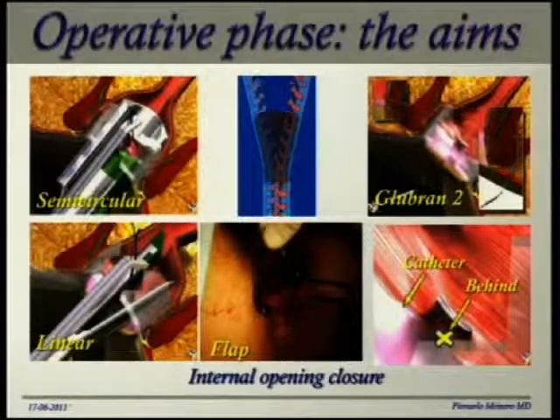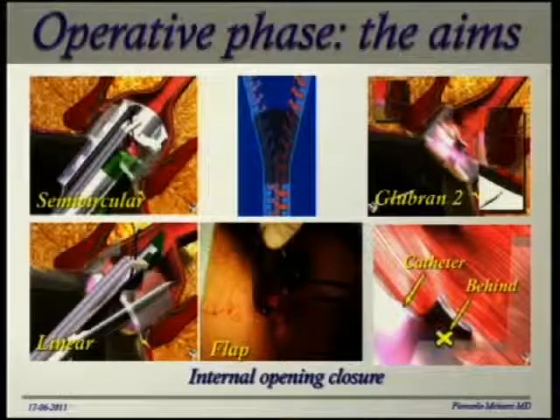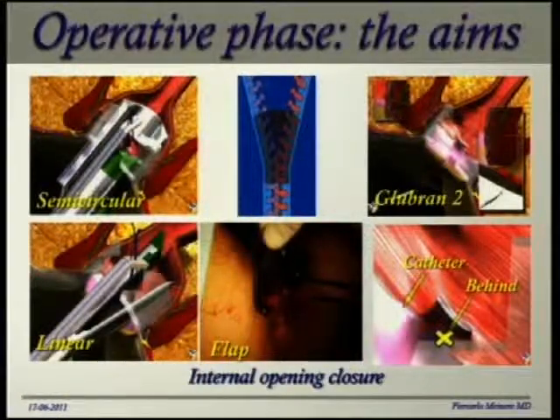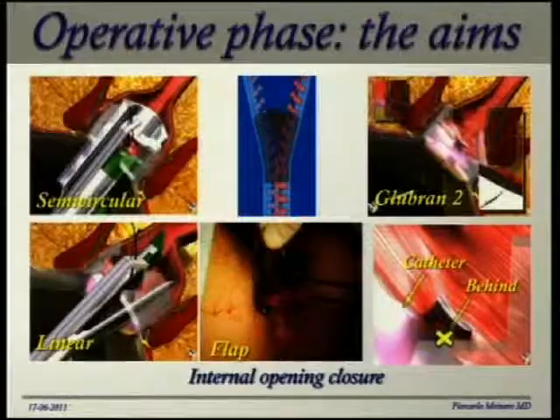The final result is simply a scar in the area where the internal opening was. But when the internal opening tissue is not sclerotic and allows you to make a good volcano, the stapler works better. But if the internal opening tissue is too rigid and sclerotic, the use of the stapler might be difficult. In that case, we can make a cutaneous mucosal flap by hand.